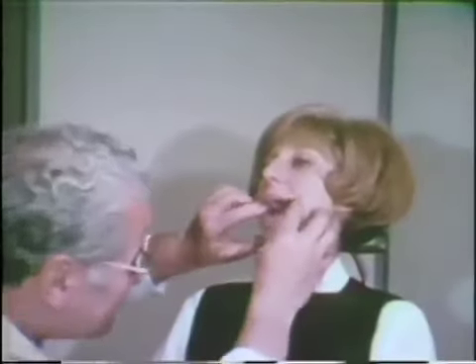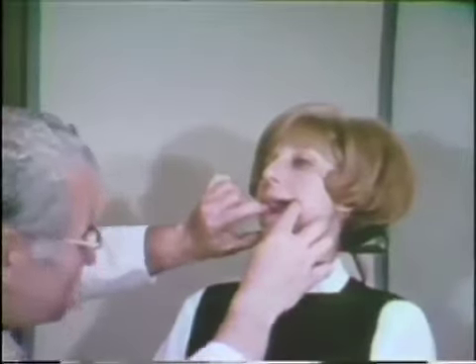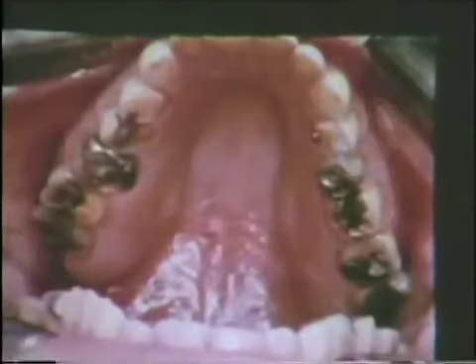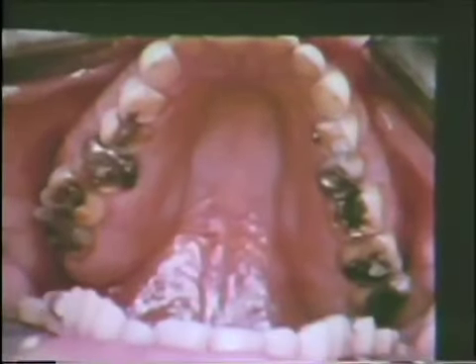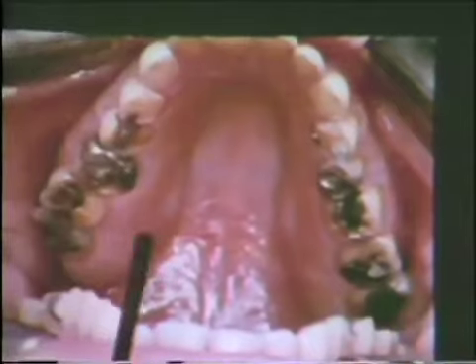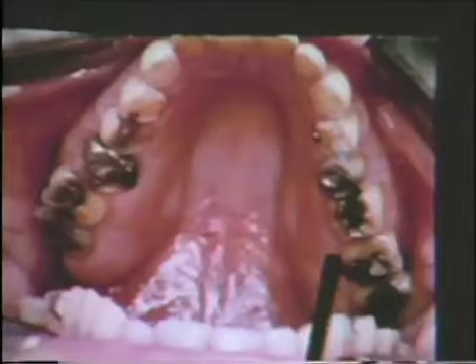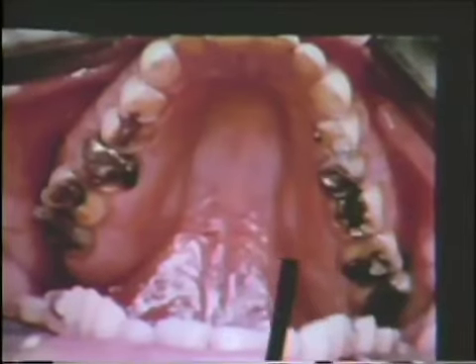The oral cavity should then be examined for any obstacles to the placement of film, and the number, placement, and alignment of teeth. In this case, the patient has a full complement of teeth quite well aligned, but the lingual aspect of the maxillary ridge is quite prominent, and this could provide an obstacle to proper film positioning.